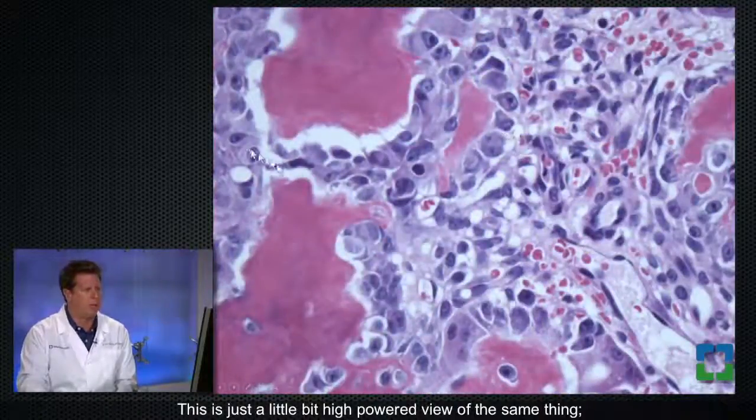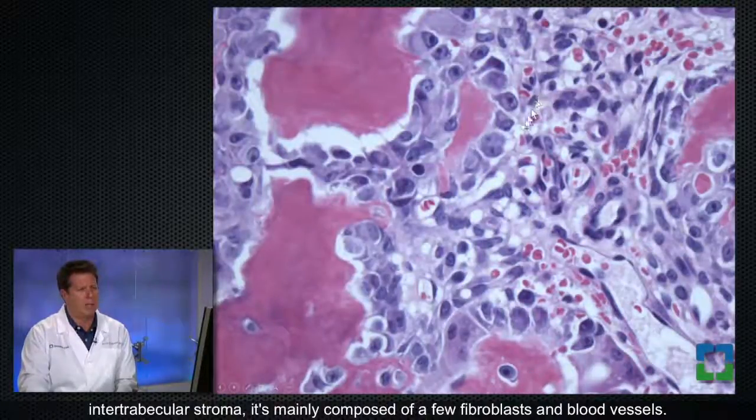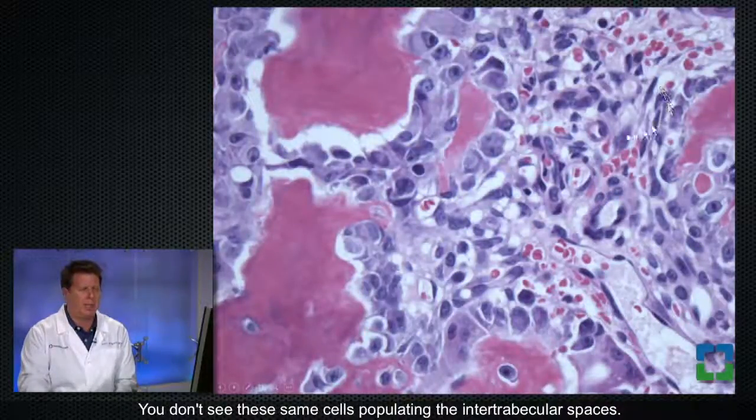This is just a little bit higher power view of the same thing. Nice rimming of very uniform, prominent osteoblasts, and then when you look in the intertrabecular stroma, it's mainly composed of a few fibroblasts and blood vessels. You don't see these same cells populating the intertrabecular spaces.